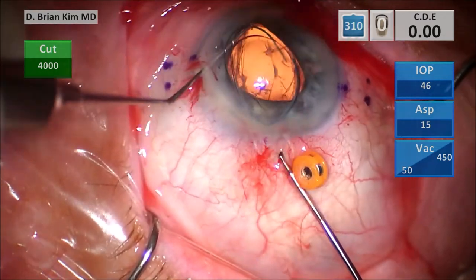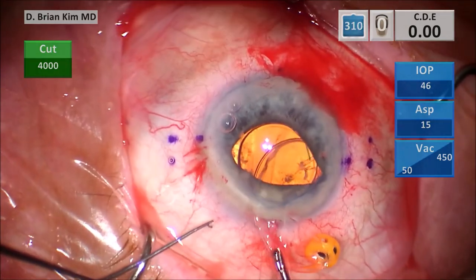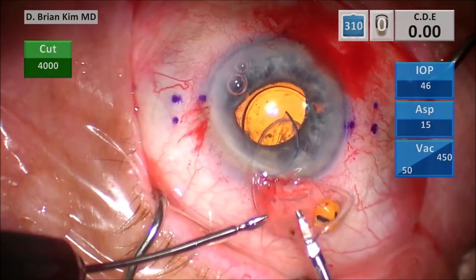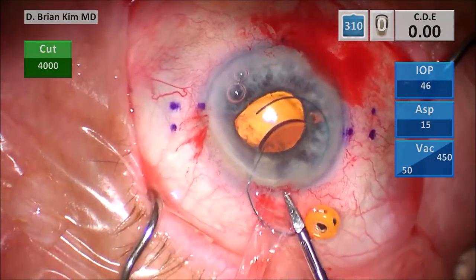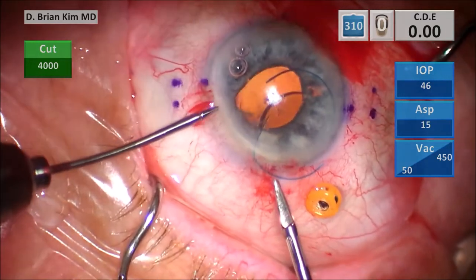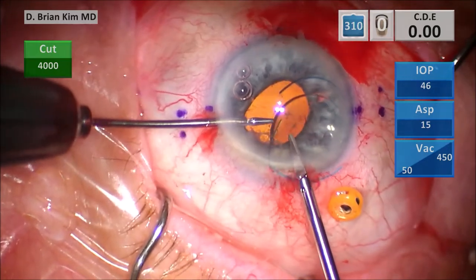As I do this, the CTR pops out of the wound — that's actually a blessing in disguise. I'm able to carefully hold the CTR up, and you can see the bag is up as well as the trailing haptic came out of the wound, so that was fortuitous for me. It took me a little bit by surprise, so I was trying to figure out what to do.